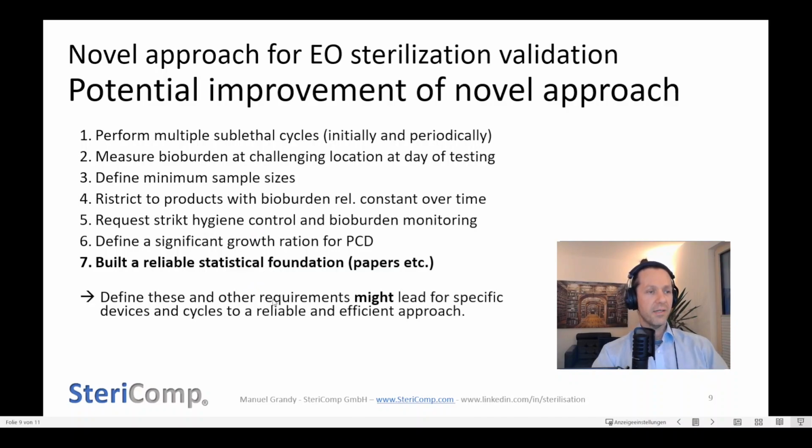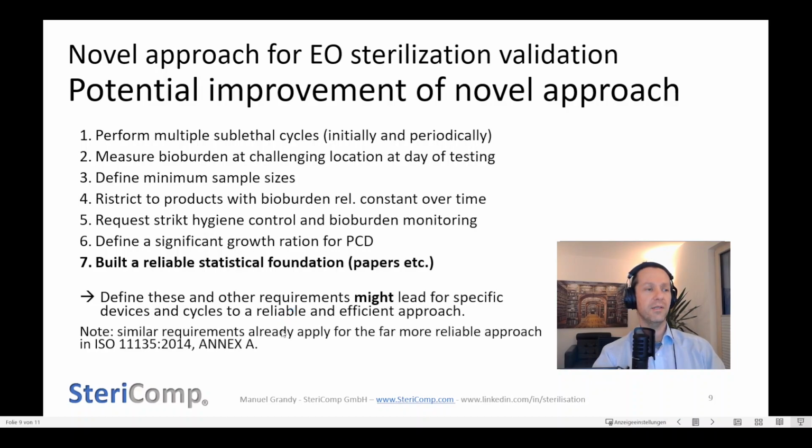So defining this and other requirements or improvements might lead, for specific devices and cycles, to a reliable and efficient approach. Similar requirements are already applicable for the far more reliable approach defined in the current ISO standard in Annex A, just as a comparison.